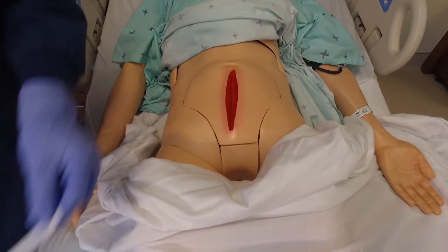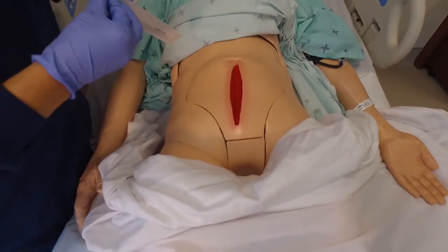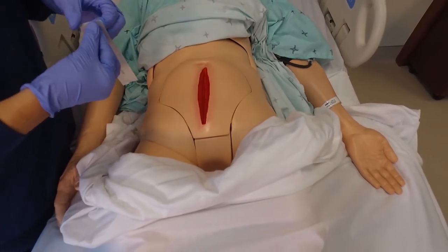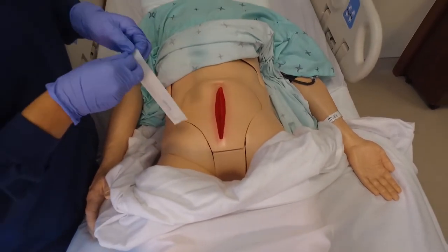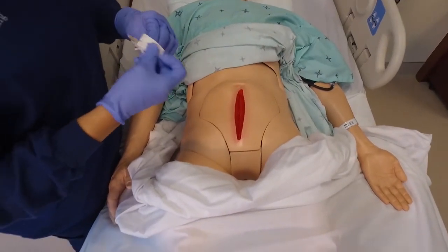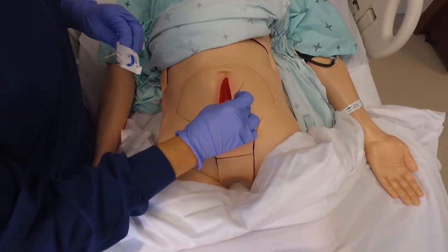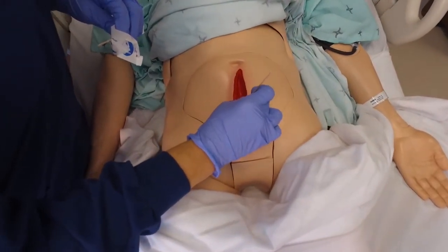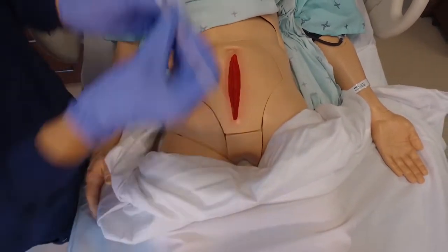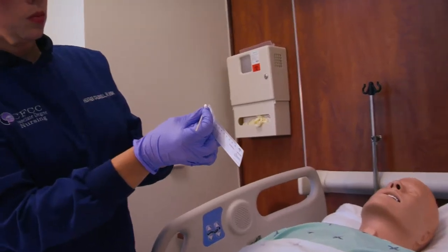To measure depth, the nurse uses a cotton-tip applicator at the deepest part of the wound, placing her fingertips at the level of the skin. She uses the measuring tool against the applicator to determine the depth.